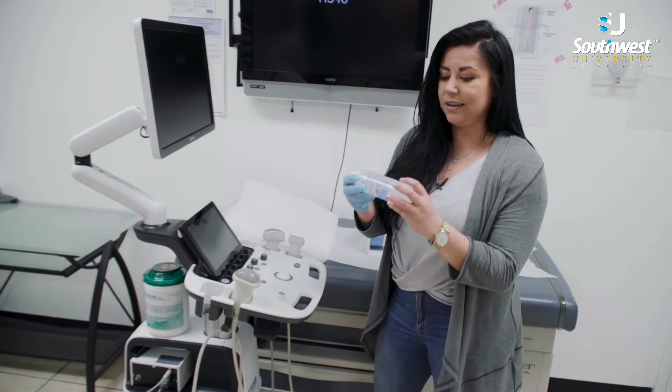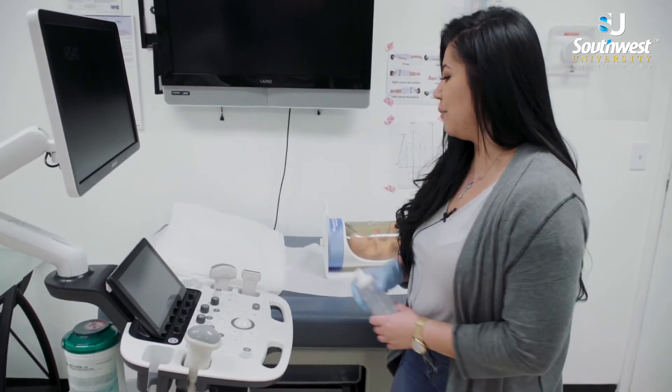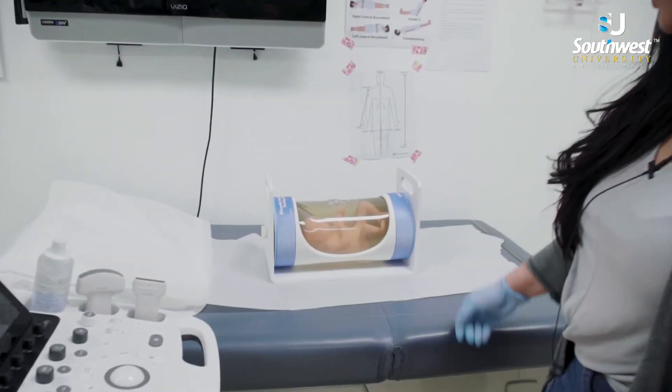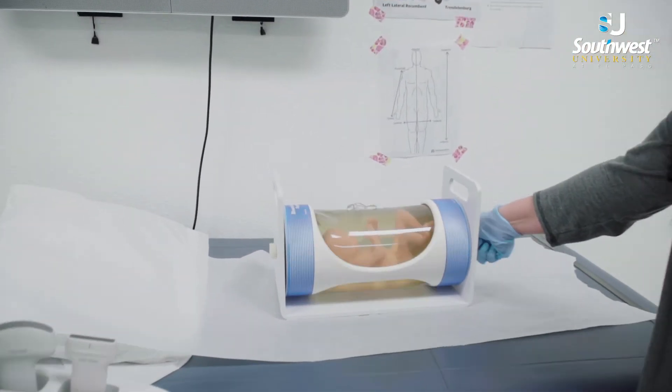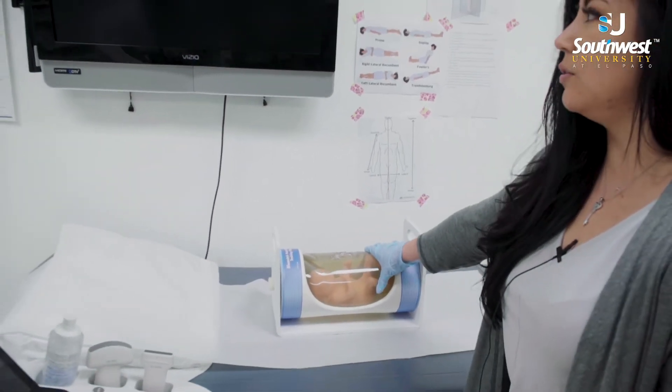The typical basic things that we're going to need is a gel — without this we cannot see anything. And of course the phantom. Right now we're using this baby phantom. This is just to get the students to recognize what they're looking at on ultrasound.